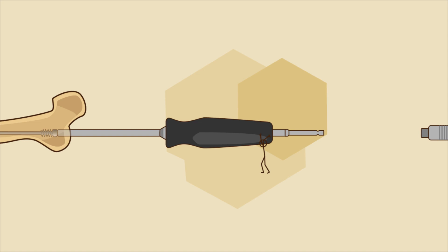Step 7. Attach the torque handle and apply counter-clockwise rotation until the limit is reached. A click sound will be heard. Remove the torque handle. Step 8. Unscrew the female component and pull to remove it from the bone.